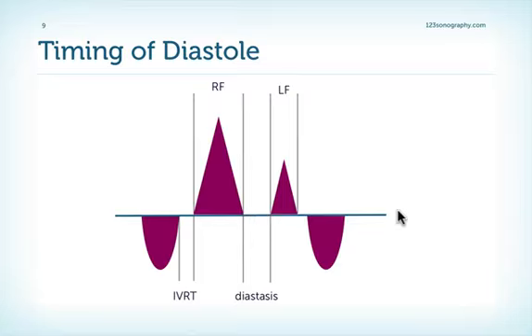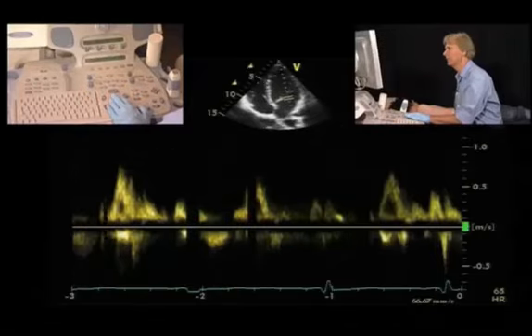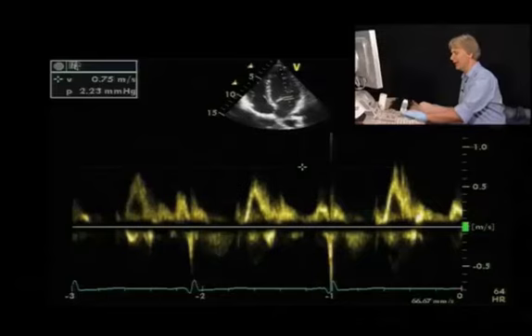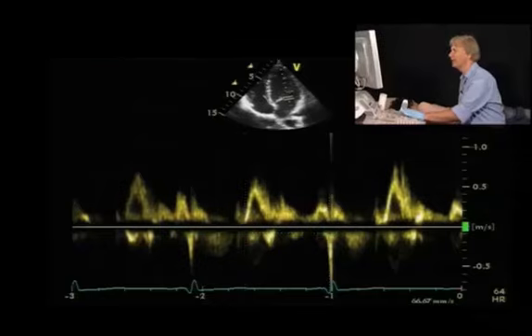How do we measure these intervals with echocardiography? To measure diastolic intervals, we need a good mitral inflow signal. We'll try to record one now from our patient here. Okay, so this is okay. What we see nicely here is we have the E wave and the A wave. The first thing we can measure now is the duration of diastole, which starts right here at the beginning of the signal and ends right here at the end. So we have 649 milliseconds for the diastolic filling time, so the duration of diastole.